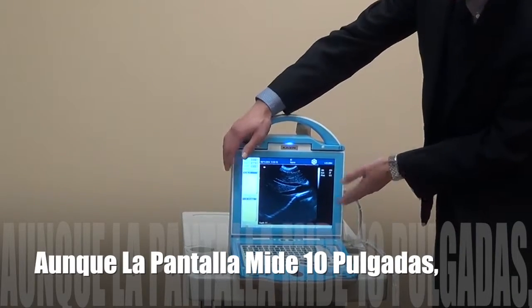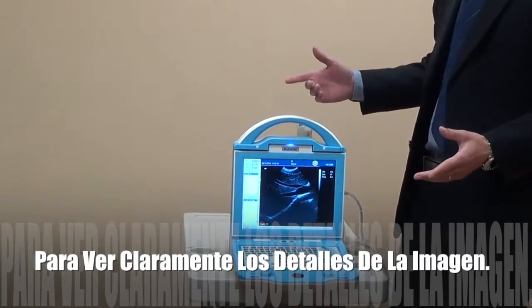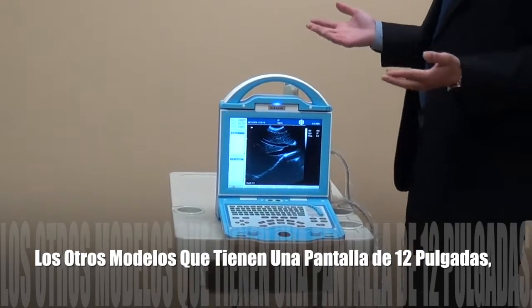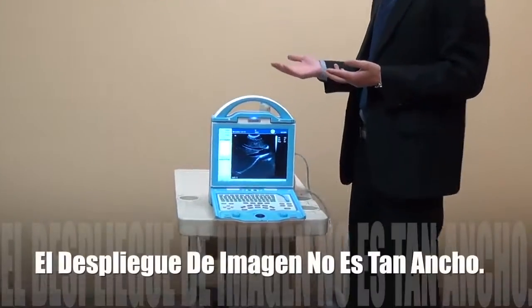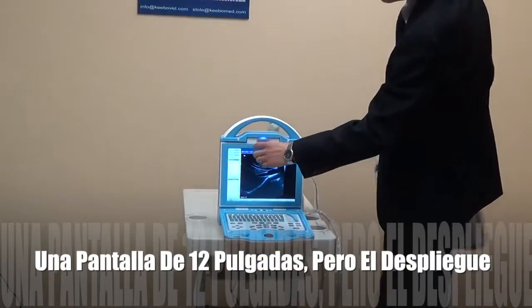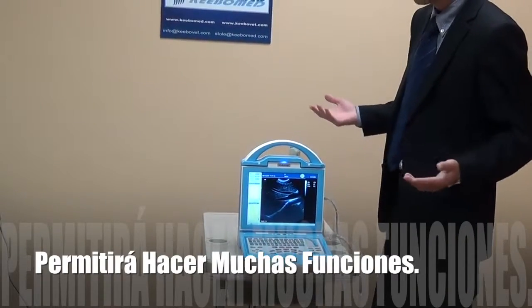Although the size of this LED display is just 10 inches, as you can see, the image area is really big enough — you can see very directly and very clearly. This is not like those models with 12 inches: even though their display is 12 inches, like this model here, the actual image display area is really very small. So you cannot get a big image to read information directly, and you need to perform additional operations.